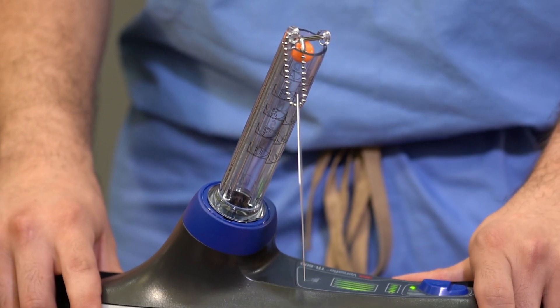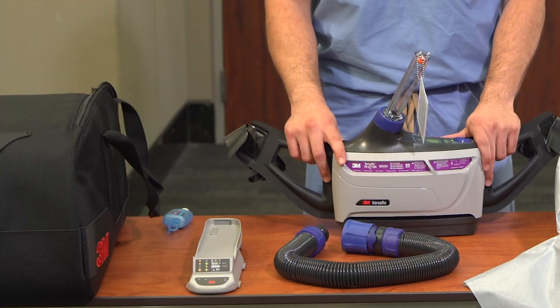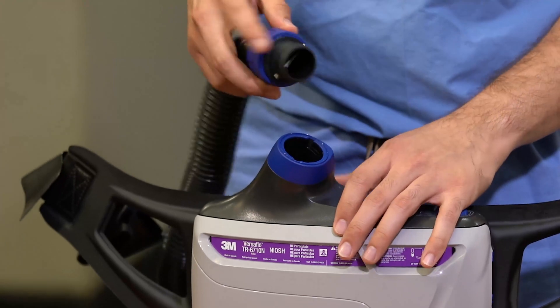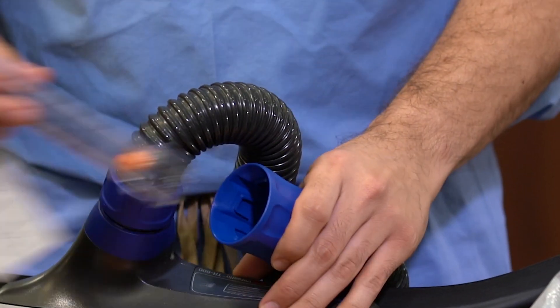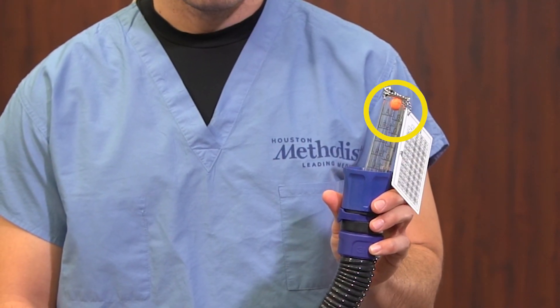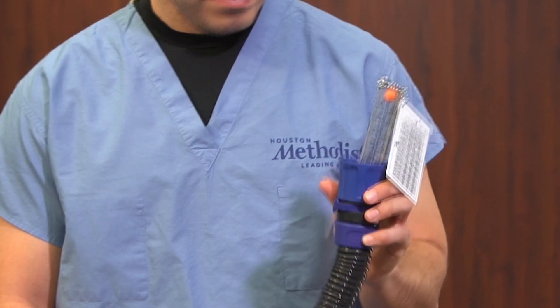If the orange ball does not float at or above the F mark, a different PAPR must be used as the device is not achieving proper airflow. Remove the airflow meter from the port and retrieve the air hose from the bag. Attach the hose to the airflow port and then attach the airflow meter to the hose. Ensure that the orange ball floats at or above the F mark in the meter — this will ensure that the hose is not damaged or obstructed.